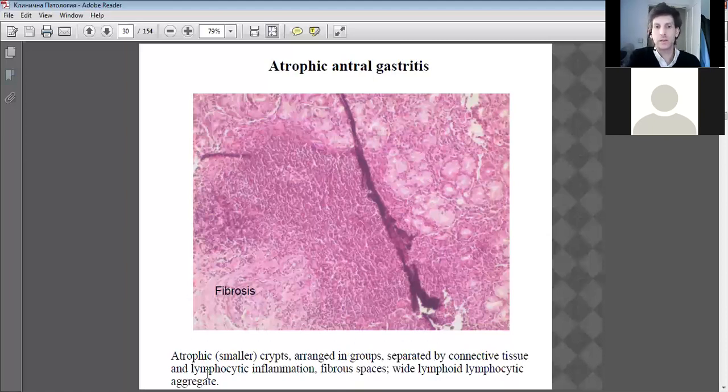So yeah, he mentions lymphocytic inflammation, certainly. Yeah, there'll be lots of that, secondary lymphocyte attack as well. And the wide lymphocytic aggregates. These would be occurring in this area, the darker purple, yeah, of this area of inflammation. The darker area would be the aggregates of the lymphocytes.